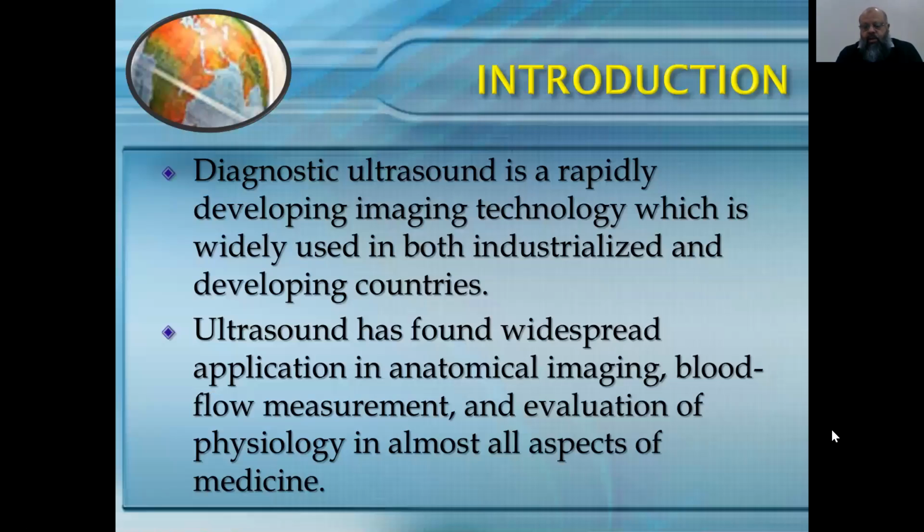First is introduction. Diagnostic ultrasound is a rapidly developing imaging technology, which is widely used in both industrialized and developing countries. Ultrasound has found widespread applications in anatomical imaging, blood flow measurements, and evaluation of physiology in almost all aspects. For evaluation of physiology, I can give you the example of fetal echocardiography or adult echocardiography, in which you can see the real-time things which are changing.